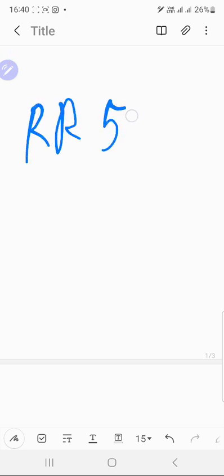So, here I will try to explain quickly why, in a patient with obstructive airway disease like cystic fibrosis or asthma, increasing the rate will not always end up giving a low CO2. Sometimes you can decrease the rate to get a better E time and have a lower CO2. So what happens? Suppose in this patient you were giving a respiratory rate of 50 and I time was 0.45.